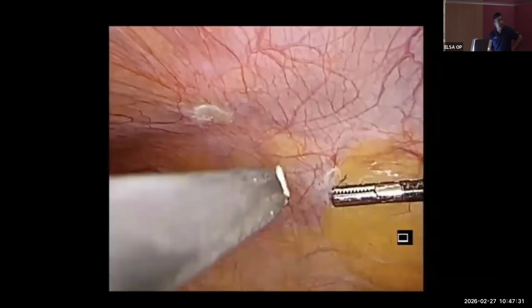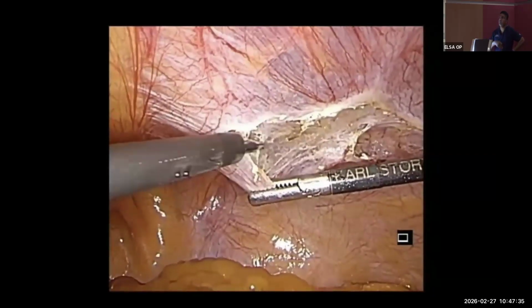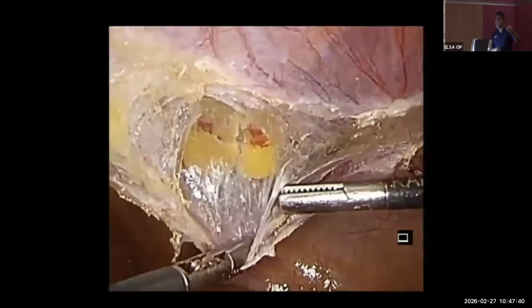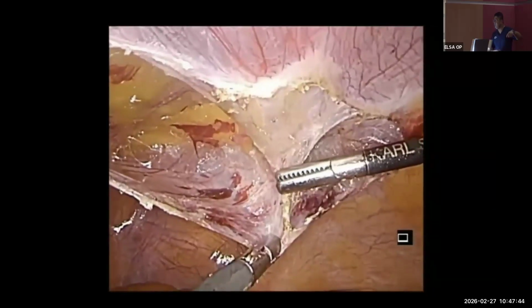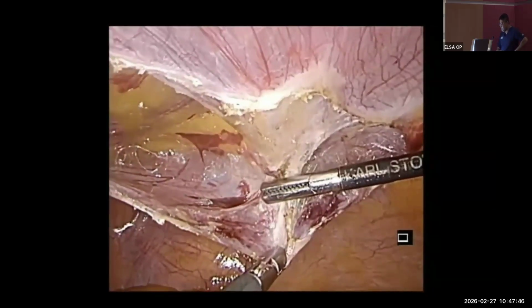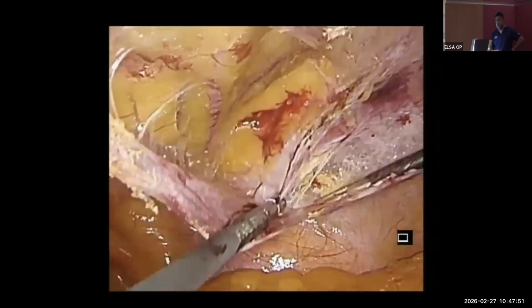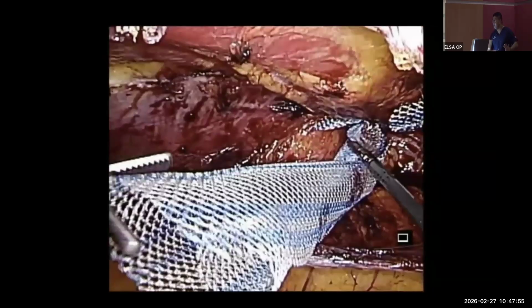There's usually a structure that connects the iliac vessels and the inferior epigastric. This is a fibrous structure. So usually the limit is until you meet this structure, which is like a sling. It slings your vas deferens in males or round ligament in females. Or you feel there's adequate coverage until the mesh can fall back without folding.